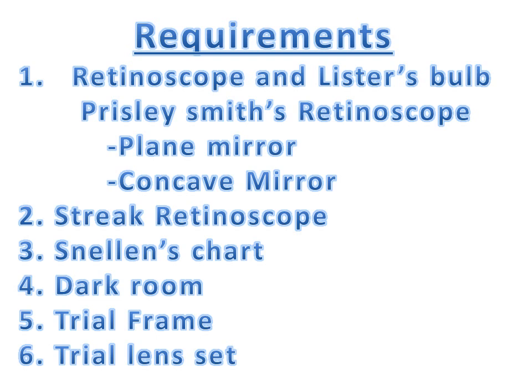Next, you have to have a Snellen's chart. When you ask the patient to look at a Snellen's chart, it is something like looking at a distant object. Patient should look at a distant object while you are doing retinoscopy, which is very important in calculating the proper spectacle power in a patient.